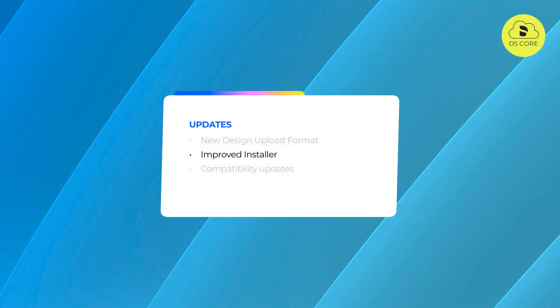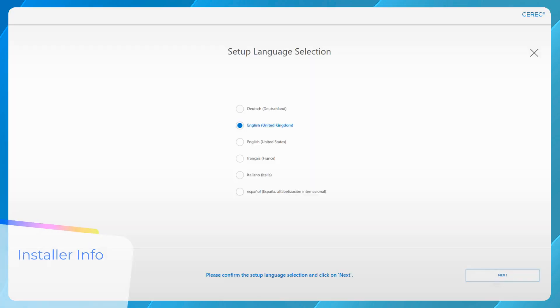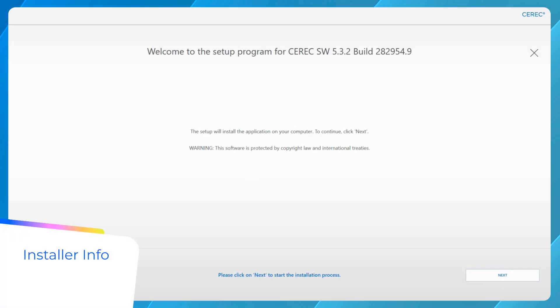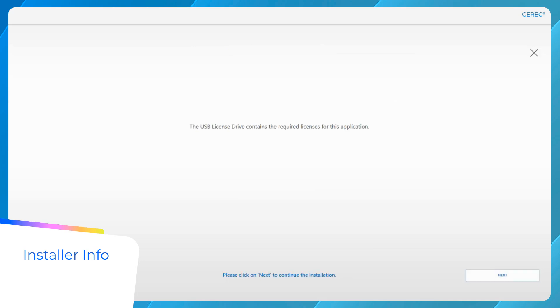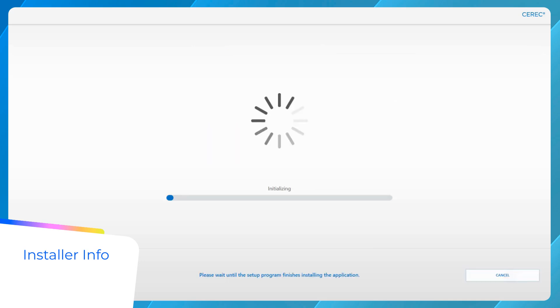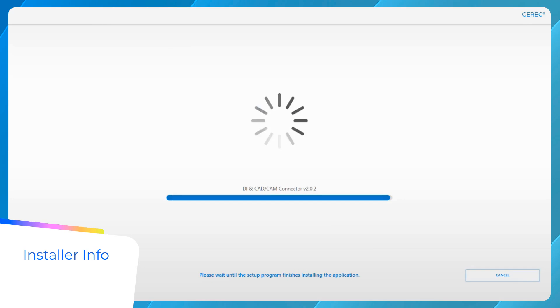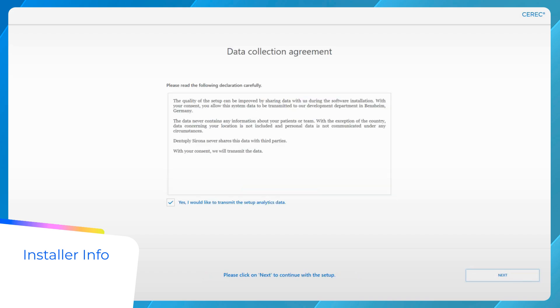We have made it very simple to install this update. The installer for version 5.3.2 now also includes the latest DI and CAD CAM connector version 2.0.2, eliminating the need for a separate update. Upon completion of the installation, the CEREC software will open, and the updated connector will be already configured with the user's DS Core account details.